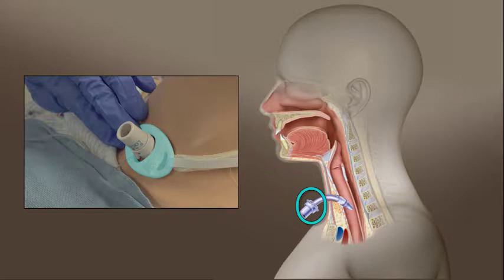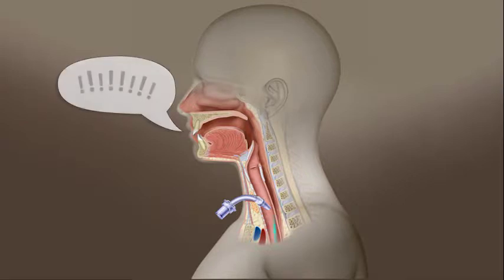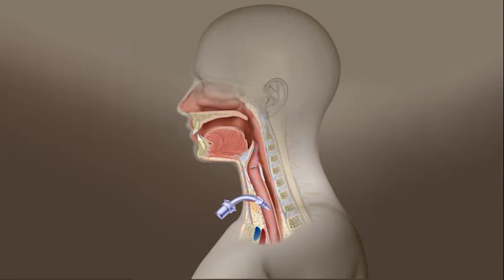When you are concerned about decannulation, you must first inspect the tracheotomy tube in the stoma. The flange should be resting up against the skin. If the tracheotomy tube flange is away from the skin and you can visualize the cuff or the end of the tracheotomy tube, the tube is most likely not in the trachea anymore. Another reason to suspect decannulation is when a person is able to speak more loudly and clearly than before. This can occur because air is no longer able to pass through the trach tube and is instead passing through the voice box and nose and mouth.